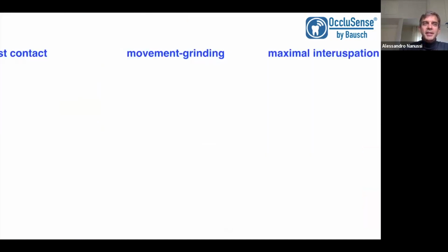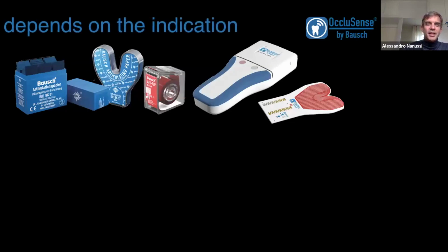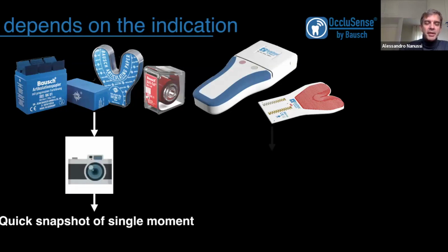But the difference between the occlusal paper and using the OccluSense is that with the occlusal paper, I can see only the final maximal intercuspation. I take a picture of the occlusion, but it is difficult to check the first contact before the movement of the jaw. We usually see only the end of the travel of the tooth at the maximal intercuspation. So it depends on the indication. You can choose your preferred occlusal paper, but remember that occlusal paper is a quick snapshot of a single moment.